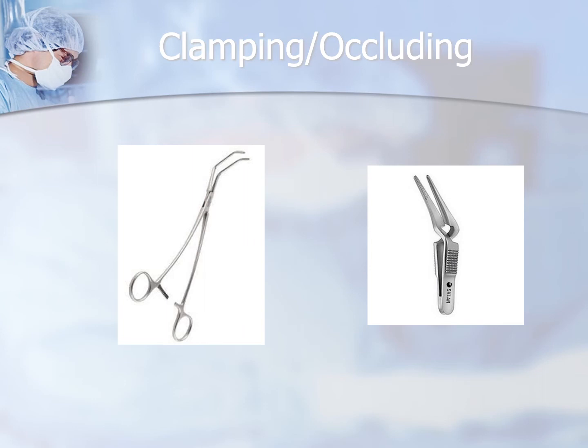Our next category is clamping and occluding. So we've talked about hemostats, Mayo-Pean, curved hemostats, straight hemostats, straight and curved Crile and Kellys, straight and curved mosquitoes. There's a variety of different clamping and occluding clamps. There are also a bunch of different vascular ones. So here's a couple of vascular ones that I picked out to show you.